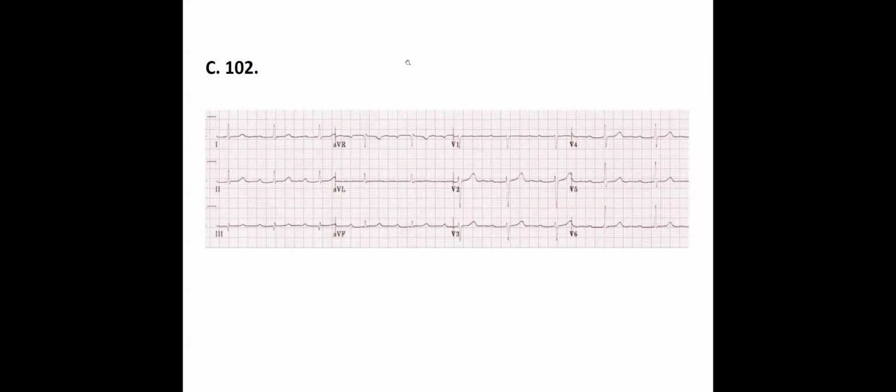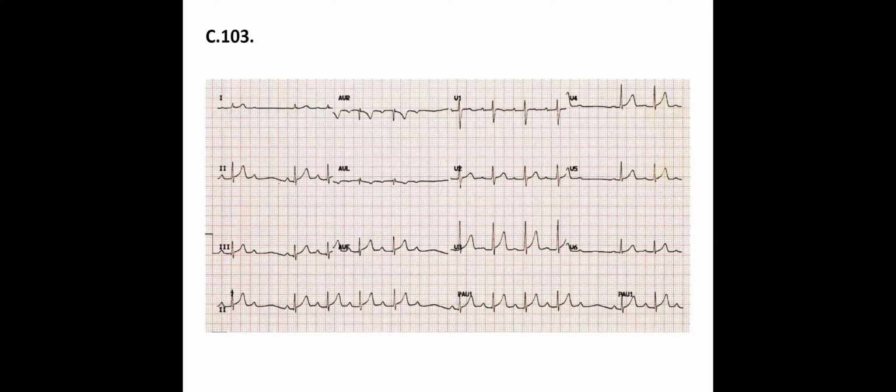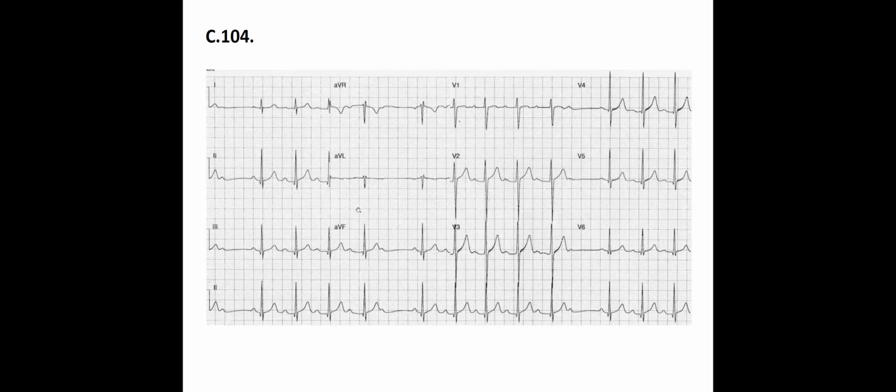Let's go through 102. Anybody? Okay. 103. Yes, me. Could you give me a little time, please? I'm going back. Okay, thank you very much. I'm back. So that was 104, yes? Mine is 103. Okay, I'm going back to 103.